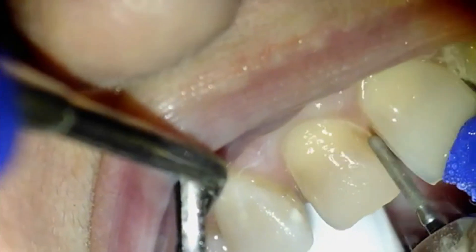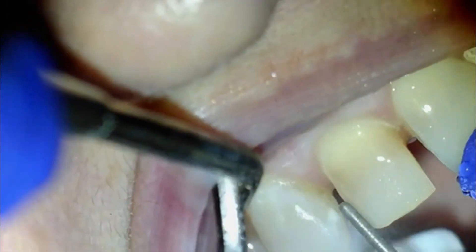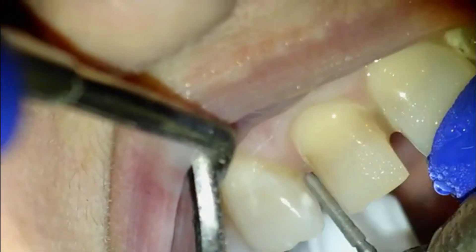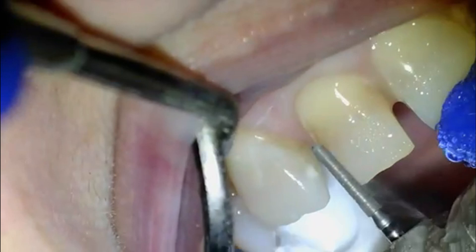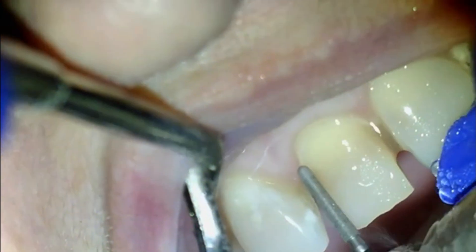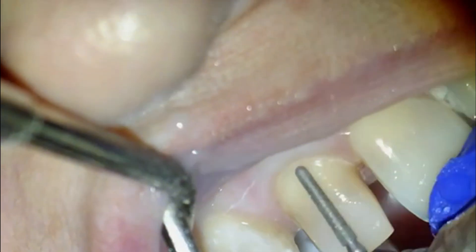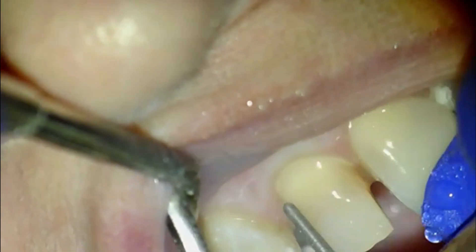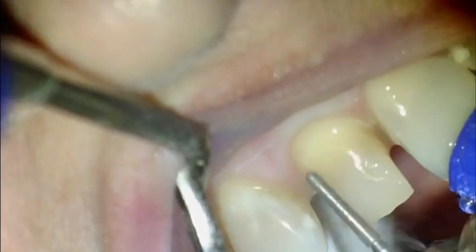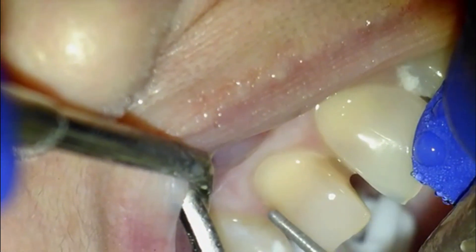What I'm doing now is removing the interproximal areas of the teeth. We're only doing these three teeth right now. We've instructed the lab to create the teeth — we do a smile design with the lab that the patient approves of. They're going to give us the three crowns for these teeth, and also a putty matrix for the other three that we will prep on the day of delivery. That way we'll be able to build the temps to the same shape, size, and dimensions of the three crowns that we put in, so that the day she leaves, she'll know what her smile will look like when we're completely done.